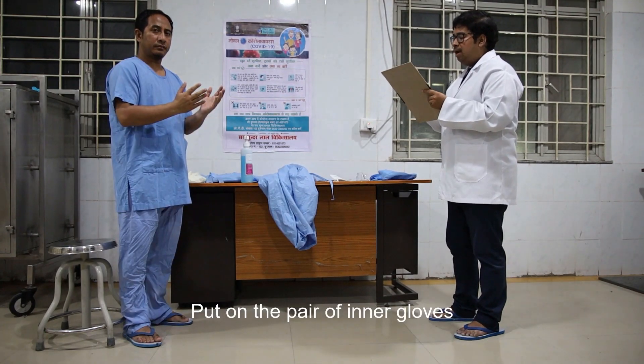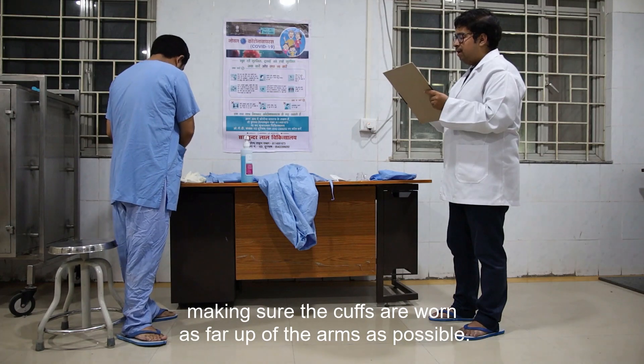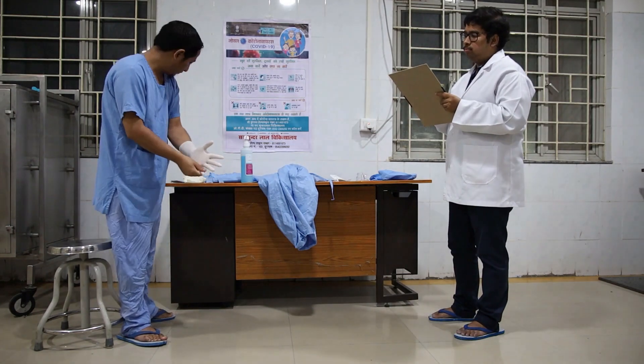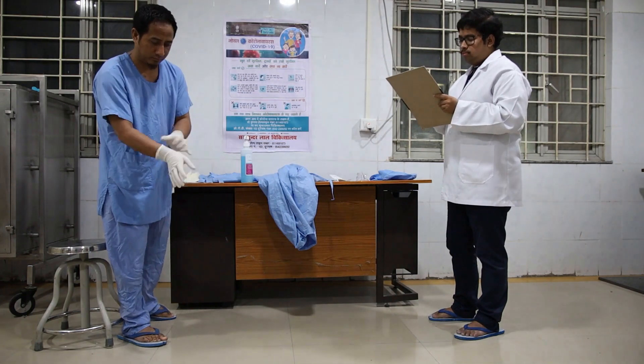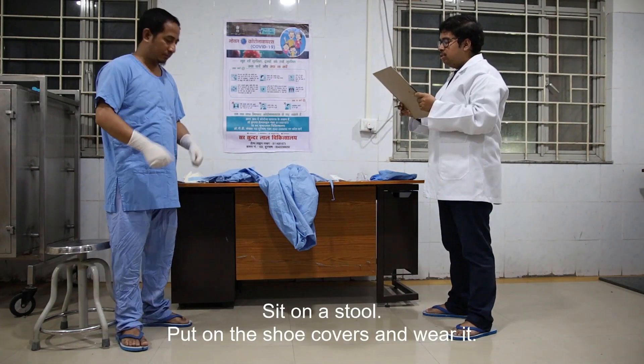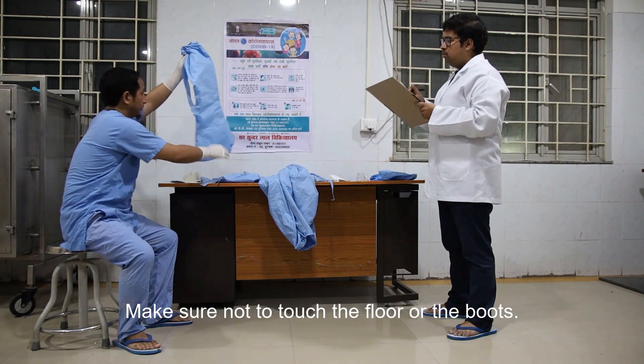Put on the pair of inner gloves, making sure the cuffs are worn as far up the arm as possible. Sit on a stool, put on the shoe covers and wear them. Make sure not to touch the floor or the boots.